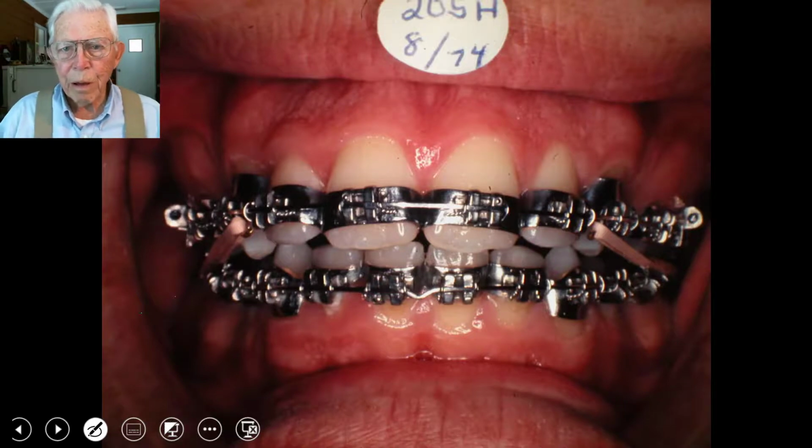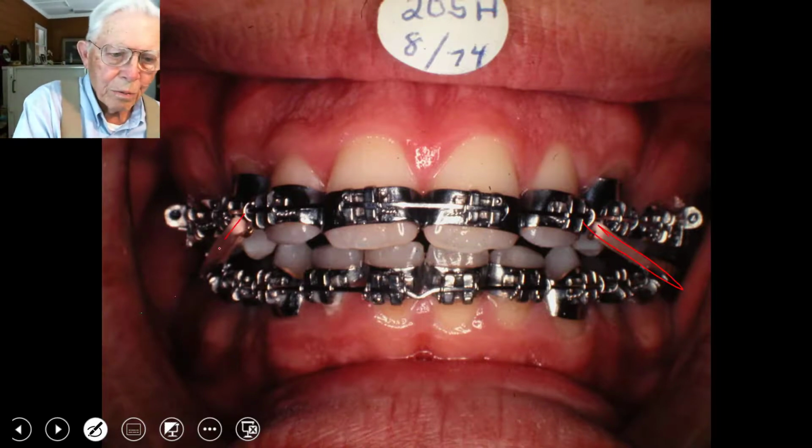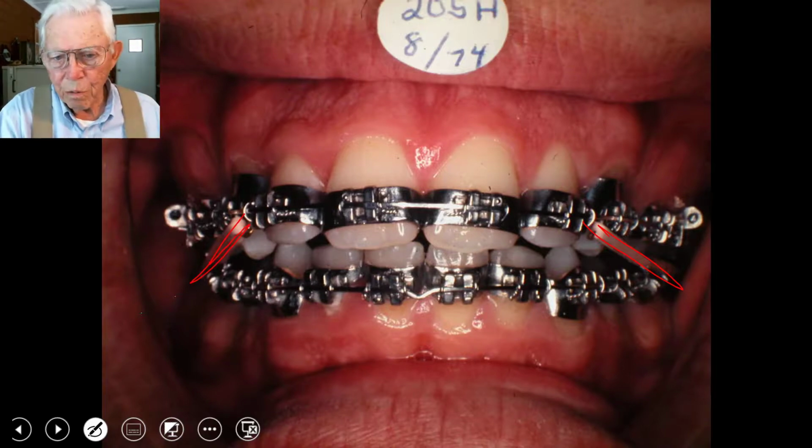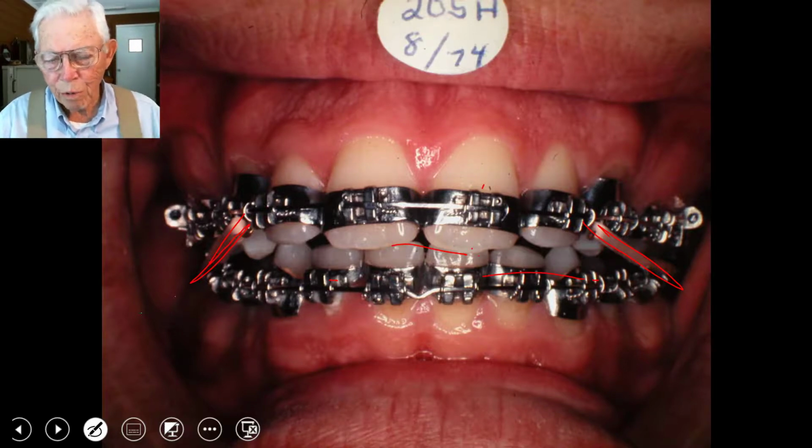All right, we come back. This is 1974, and we've banded everything in his mouth, and we have a lot of this work already done. And we're using class 2 elastics on this right here, and we're bringing these teeth back. And so we've straightened this out. We've done a lot of this work, but most of that was just regular orthodontics, such as we've been over many, many times with many cases.